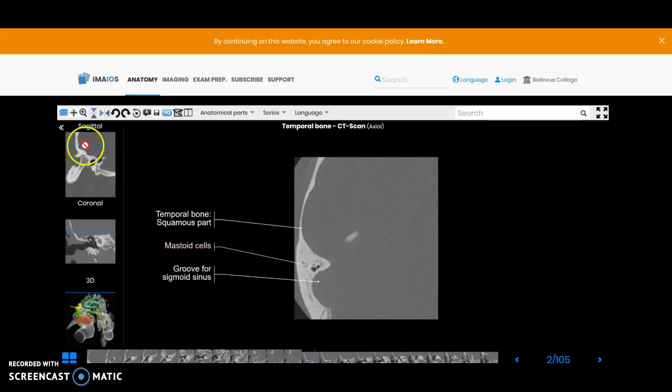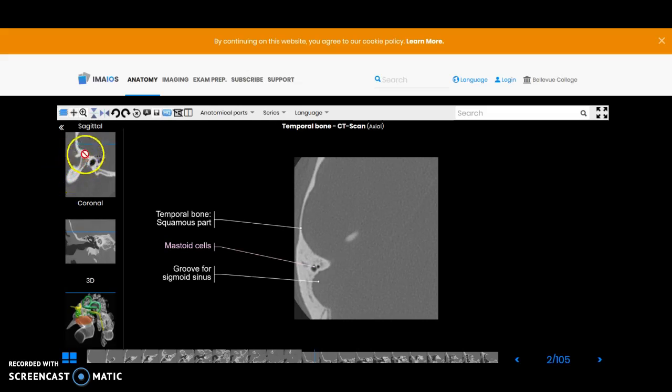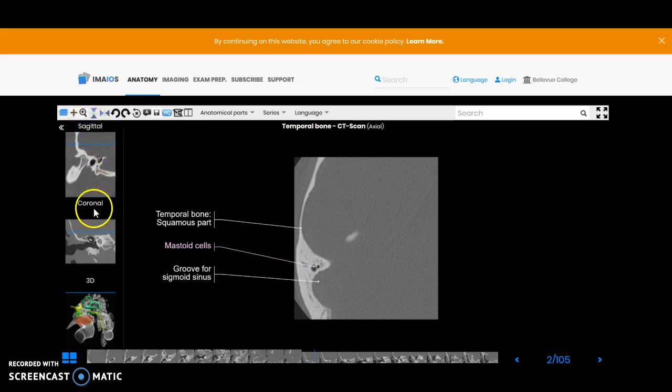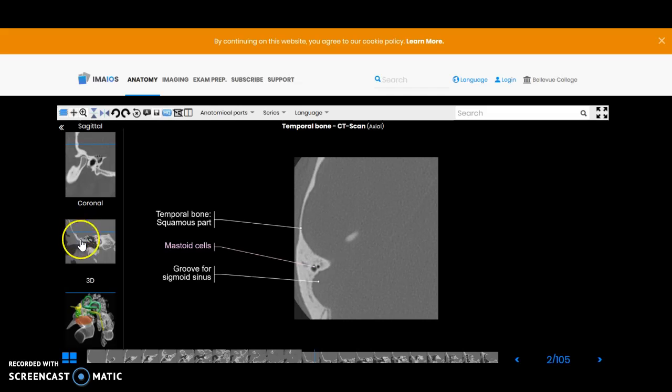Your sagittal image will stay the same. This is anterior here with the TMJ joint and this is posterior, superior and inferior. This is the right side of the patient so we're looking at the right pinna, the right auricle.